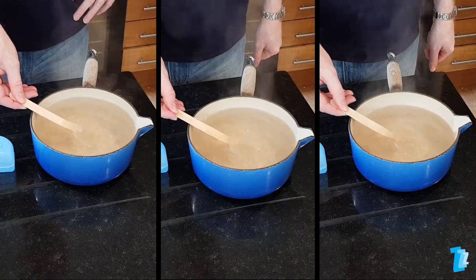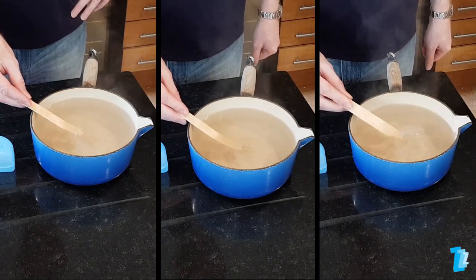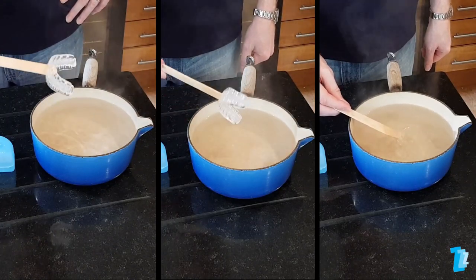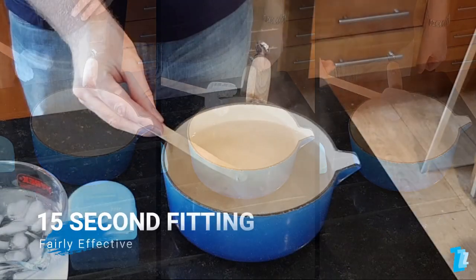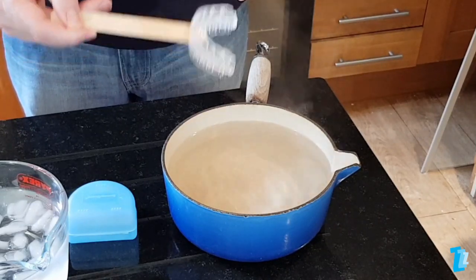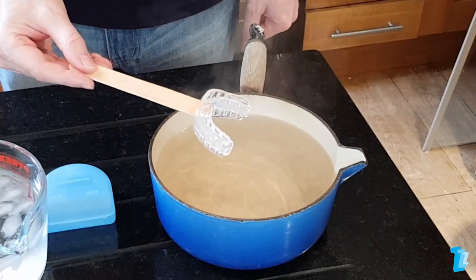Here we immerse three Somnugards for varying times: 15 seconds on the left, 20 seconds in the middle, and 25 seconds on the right. After just 15 seconds, the device can still be fitted fairly effectively, but it is slightly harder to create good impressions. If you are very unsure about the fitting process, then we would suggest this is a good timing to use. Exactly 20 seconds, and no more, is definitely the optimum time.